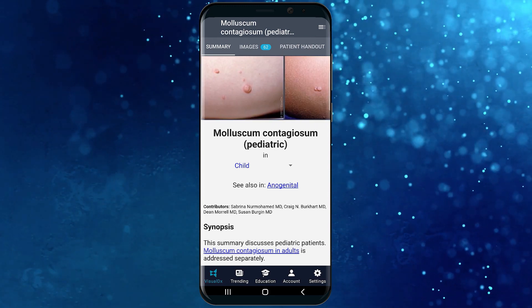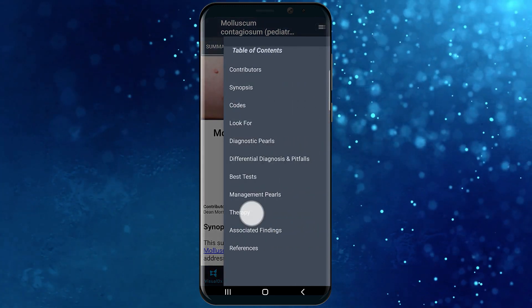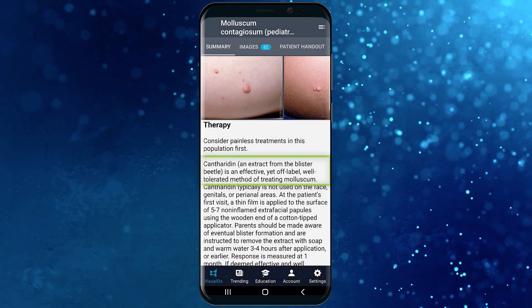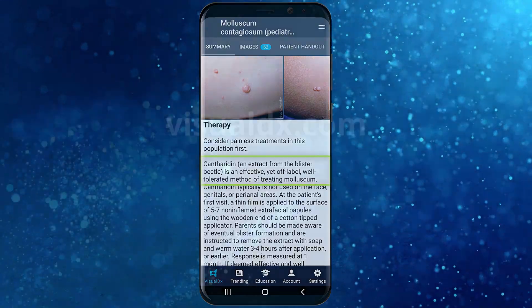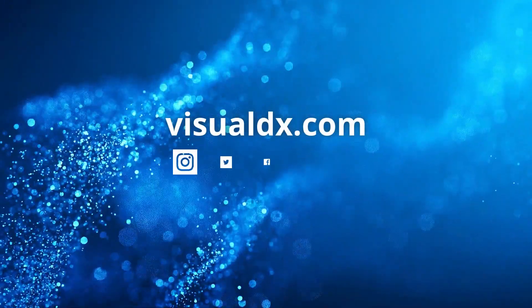The pediatrician diagnosed this patient with molluscum contagiosum and started cantharidin treatment.